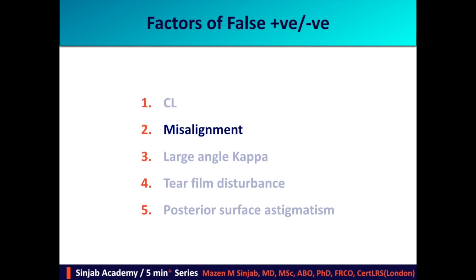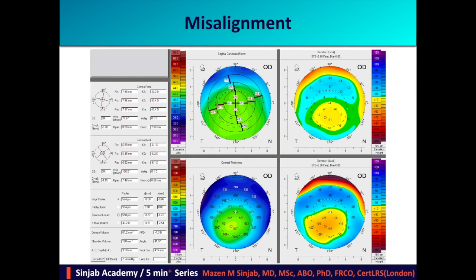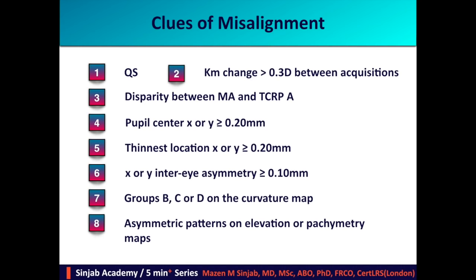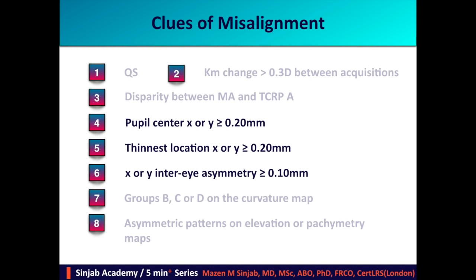Misalignment affects the patterns and numbers on corneal tomography, as in this example. As you see, this patient was looking downward while taking the capture. The curvature map shows asymmetric inferior steep. In addition, there are bulgings on both anterior and posterior elevation maps and a downward displacement of the corneal thickness map pattern. This is the same patient after proper realignment — the abnormalities have disappeared. There are a number of clues of misalignment, but concentrate on three: pupil center coordinates, thinnest location coordinates, and inter-eye asymmetry in terms of coordinates of pupil center and thinnest location.